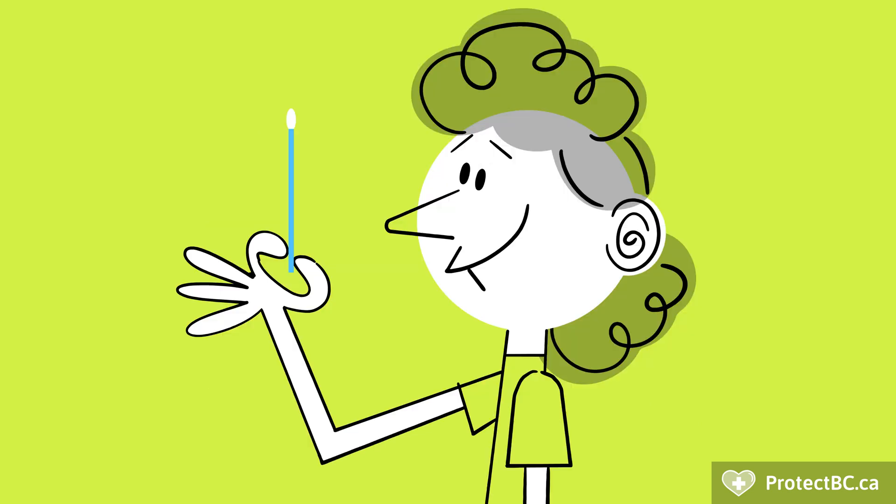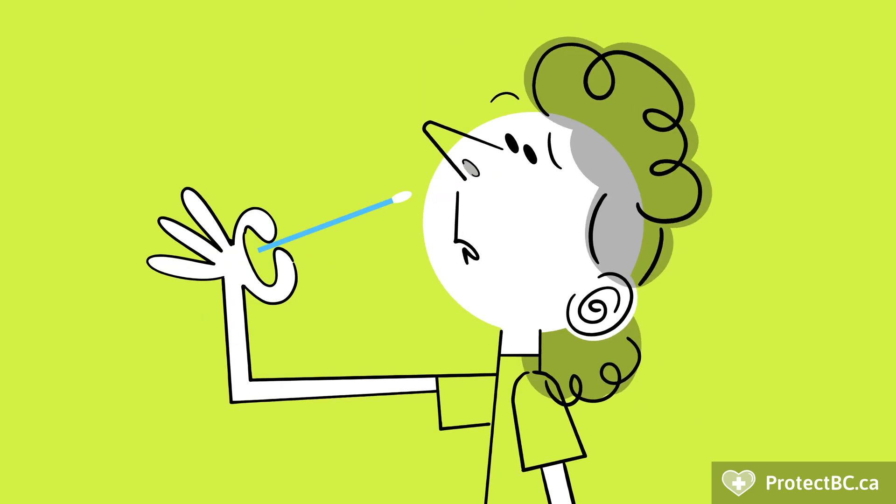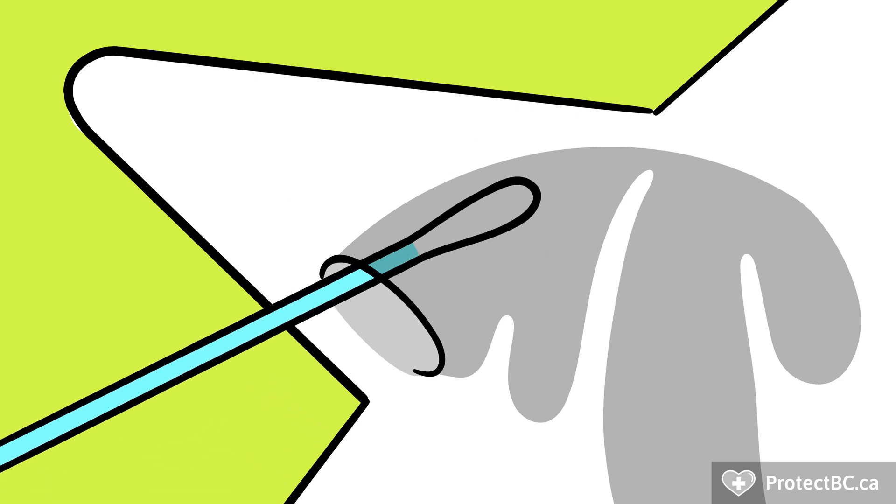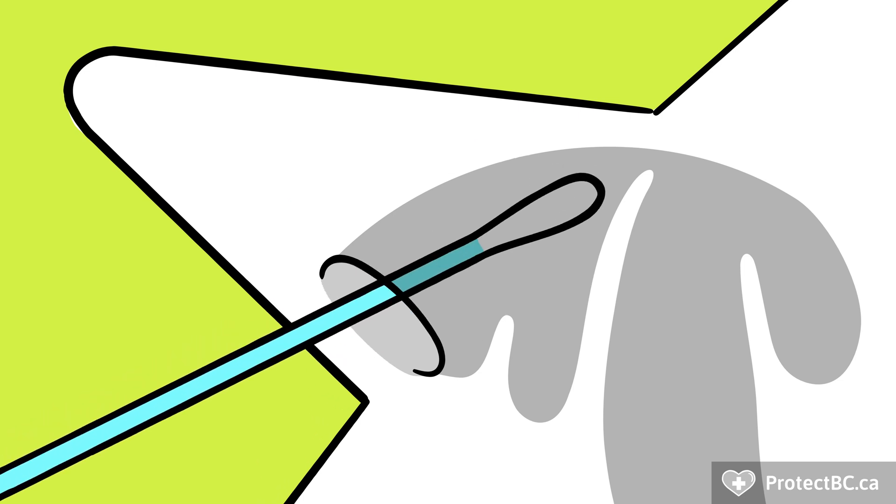Before taking your nasal swab, blow your nose. Insert the same swab into the front of one nostril, about 2 centimeters, and gently swab around the inside of your nose 3 to 5 times.